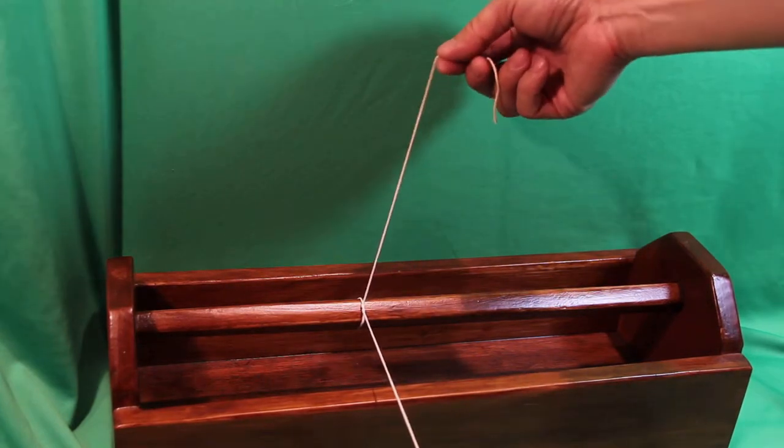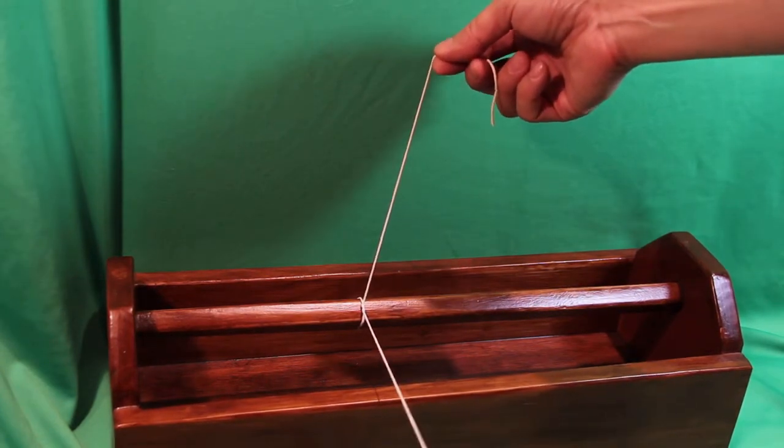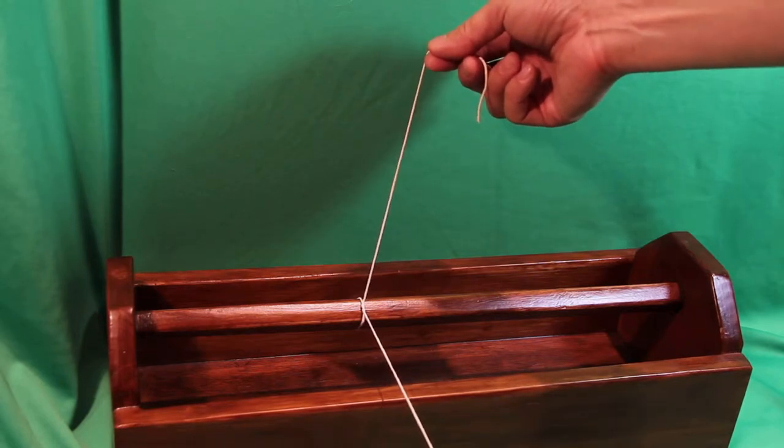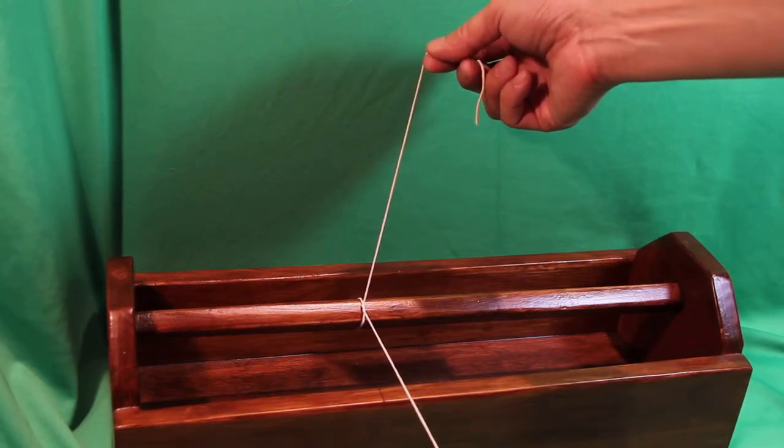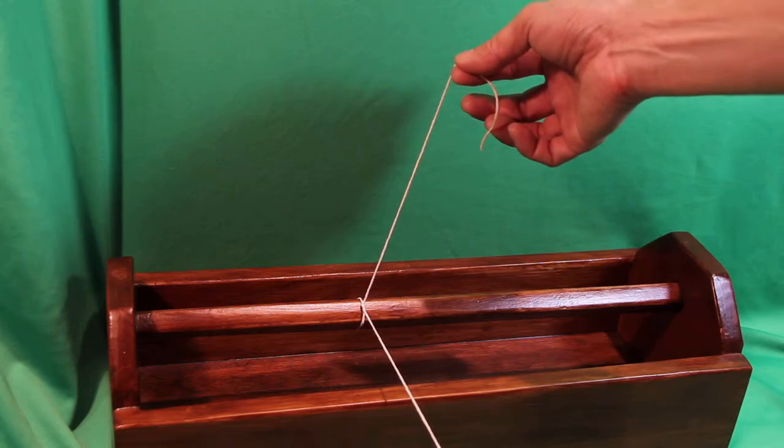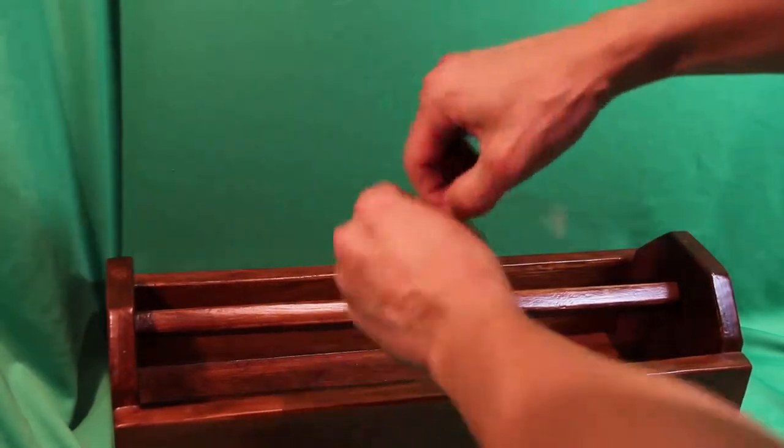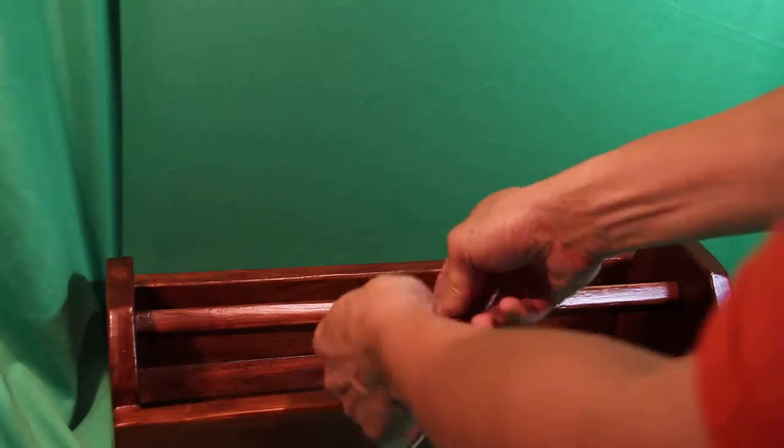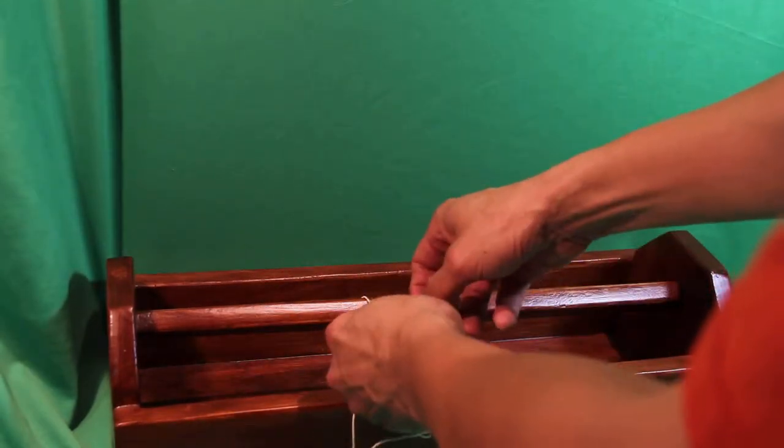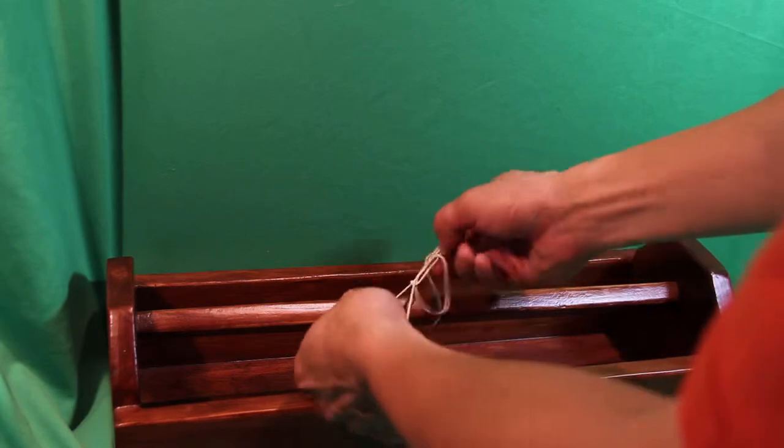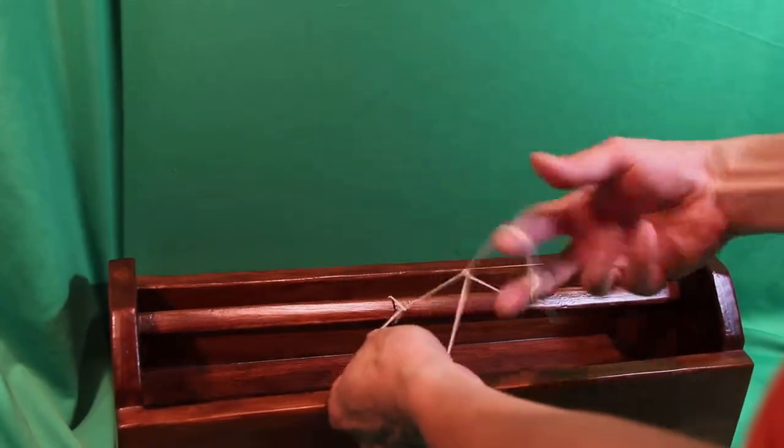So now that you master this throw, let's go with the other throw of the square knot. I suggest that you practice this first throw over and over again, like this if you will. Just do that. And that way you can be comfortable before proceeding with your second throw.